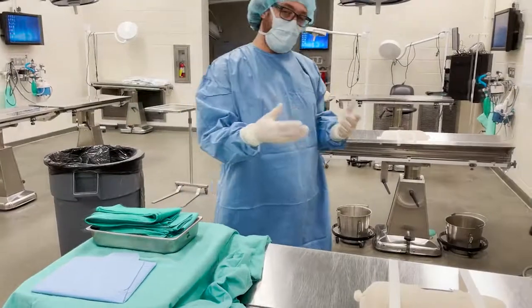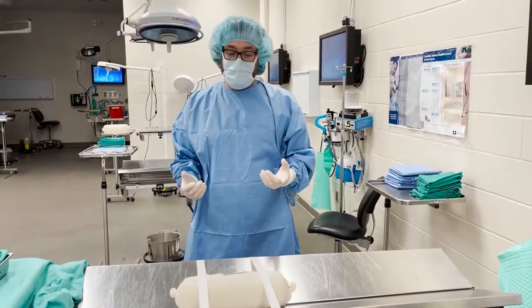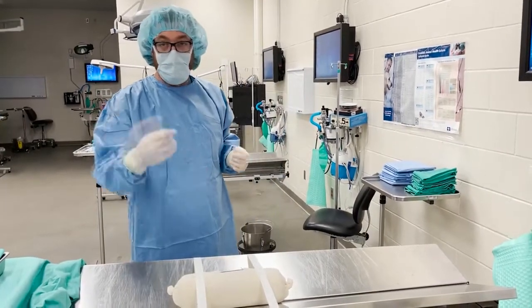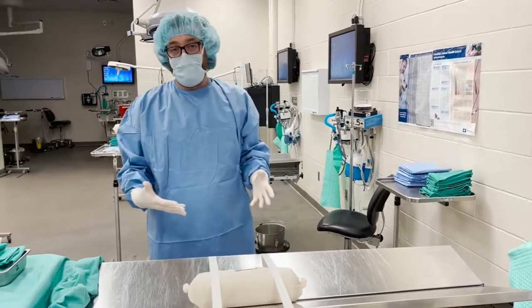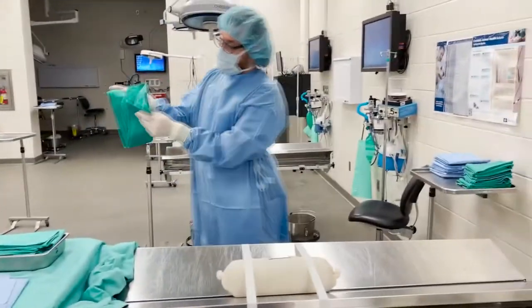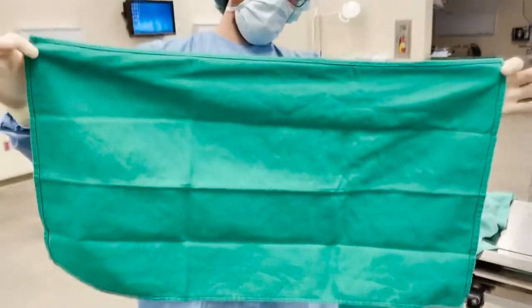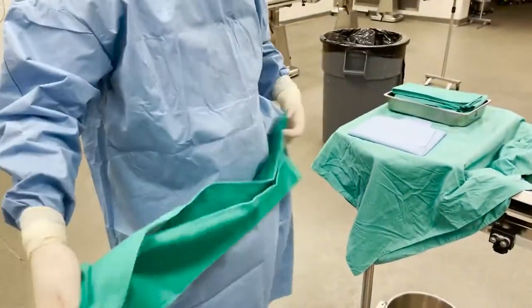If this was your patient on sterile day, you're going to have to drape by yourself because you're scrubbing while your surgical assistant is prepping. By the time you come, they go to scrub themselves and you're ready to do your patient drape — so you start with towels. The towels are folded like an accordion into thirds, then folded like an accordion into fourths. I just wanted to show you that so you can refold them if you want to practice at home.